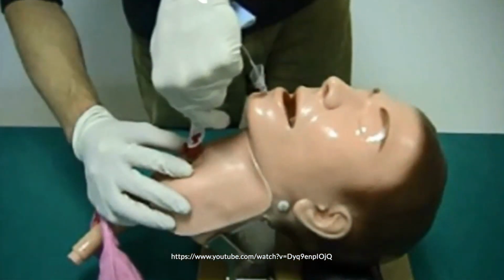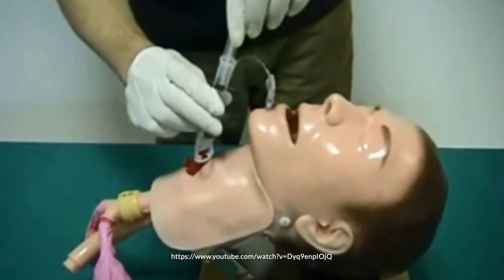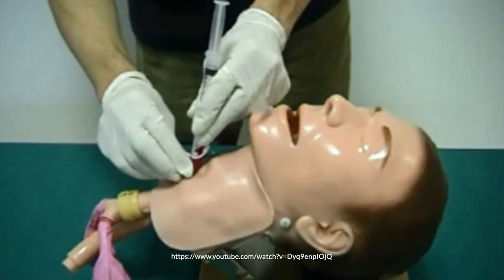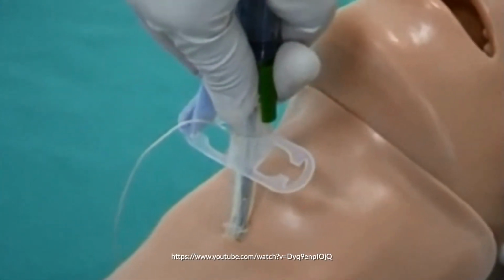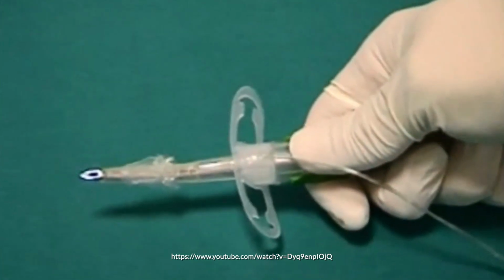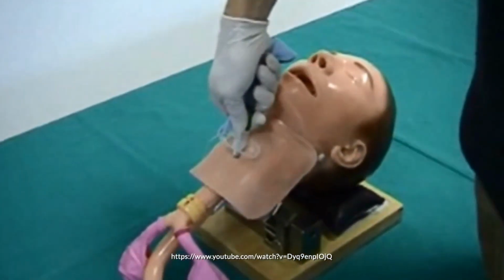Keep advancing until the red stopper is in contact with the neck. You should now be able to pull back on the syringe and aspirate air. This will indicate that the needle is in the trachea. Remove the red stopper and then push the plastic cannula forward until the green safety clip clicks into position. This indicates that the needle has retracted back into the plastic cannula and avoids the possibility of perforating the posterior tracheal wall. Now it's time to advance the device until the flange rests on the neck.